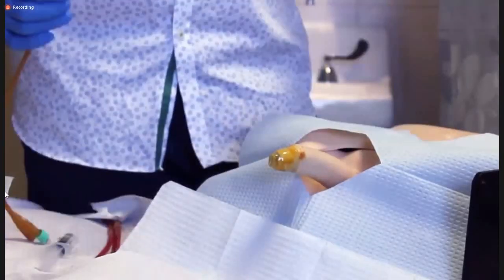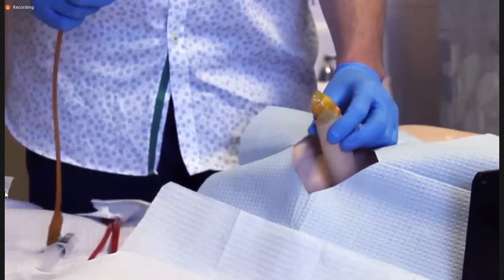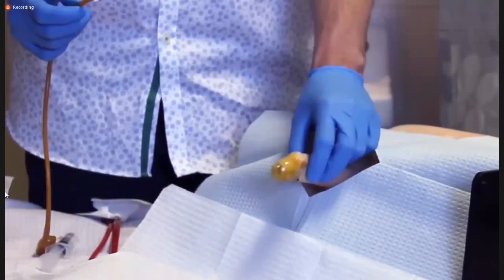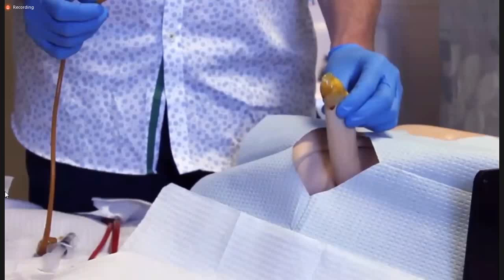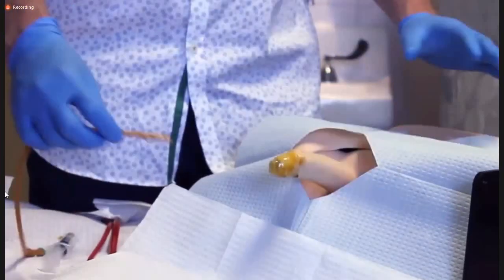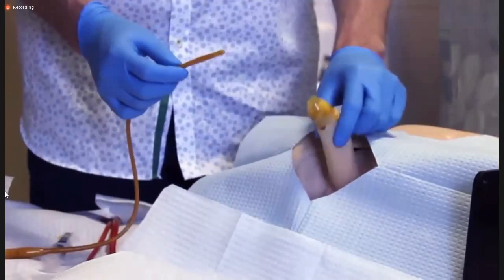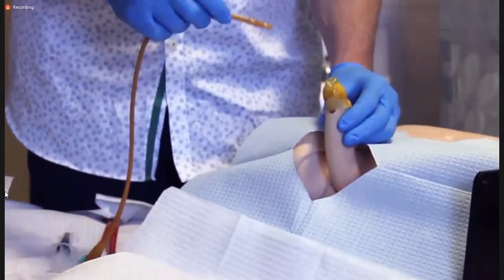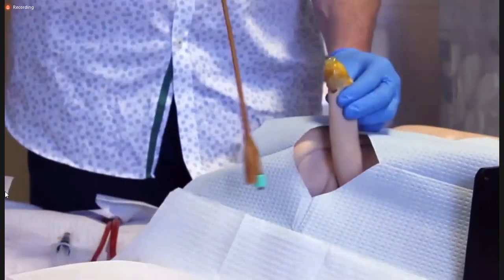Obviously, the whole time you're reassuring the patient that everything's going to be okay. When you grab the male penis and urethra, it's very important that the penis is pulled straight up and on stretch, because the urethra has a curve to it. And if you just leave the penis hanging and try and put the catheter in this way, it will be very difficult. So one of the key points is to put it on stretch, pull up to the ceiling as far as you can without hurting the patient. And then subsequently, with your well-lubricated catheter and a steady pressure, introduce it into the urethral meatus.